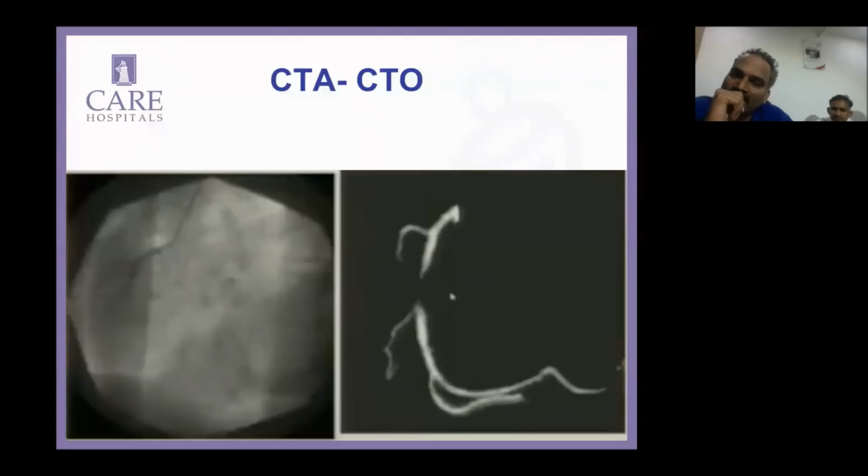So far I was thinking, if it is not visible in conventional angio, you will see some diseased vessel distally. So my assumption is wrong. And second, I just want to see the RCA angio once again, sir. Can you show us the RCA angiogram?